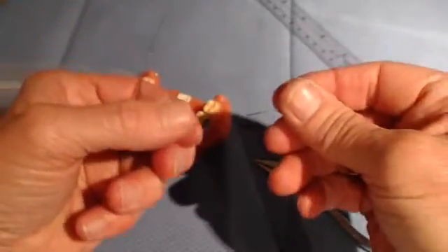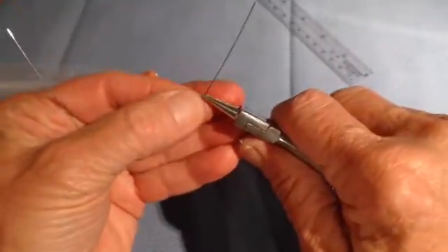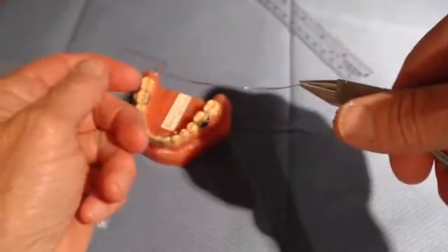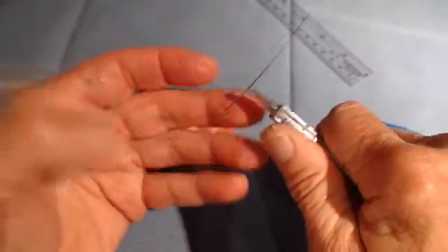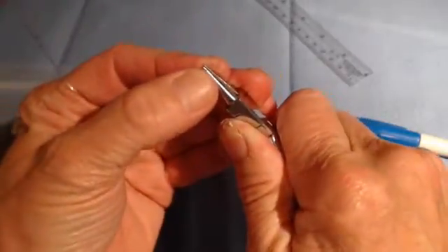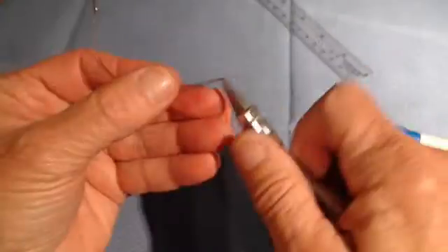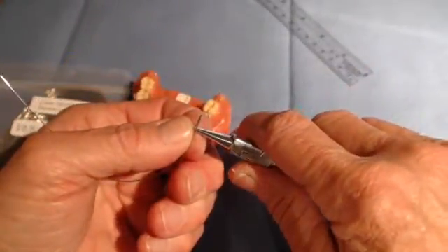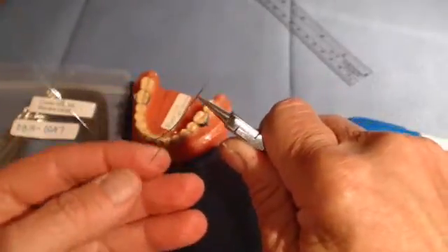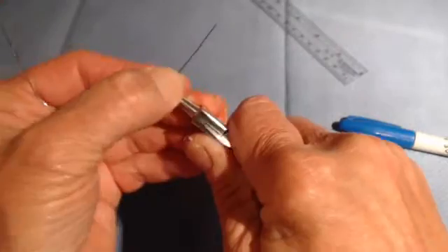I will remove the wire from the arch — try not to rub off the mark. Put the plier right on the mark. Again, you can see I'm perpendicular to a tangent on the curve and parallel to the occlusal plane. Hold very, very tightly. Bend the distal fragment over the top until the two ends are 180 degrees and now parallel to each other. Mark at the mesial aspect of the tube, which is three millimeters forward of that. Hold very tightly.